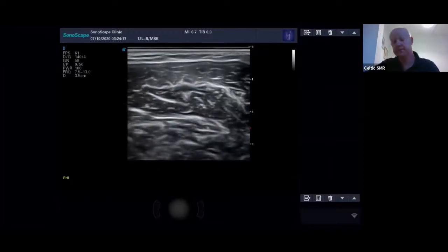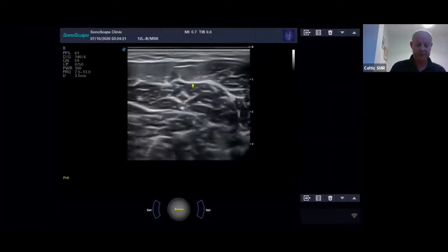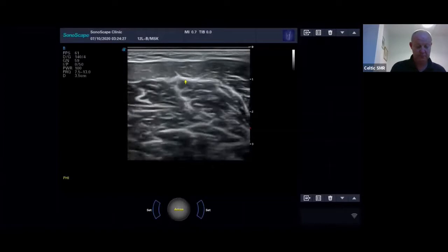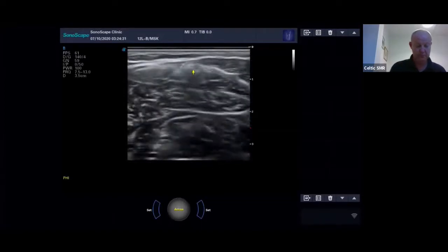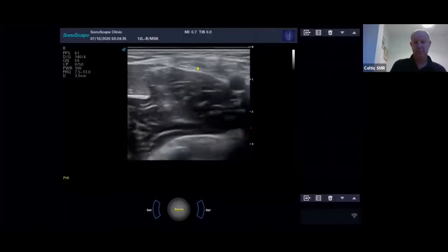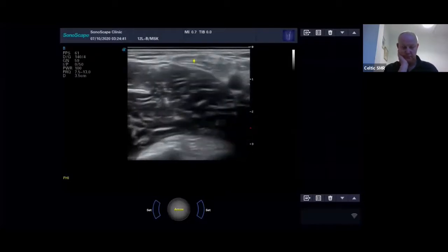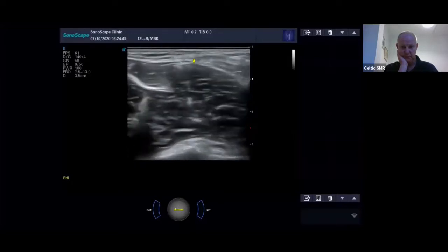And if I get my, I don't know. So you can see, and what you're looking for is this intramuscular septum here. Because as I go down, you'll see this migrates, keeps migrating, and then this becomes the tendon. Okay, so you've got the tendon, and I'm just going to defrost my glasses again.